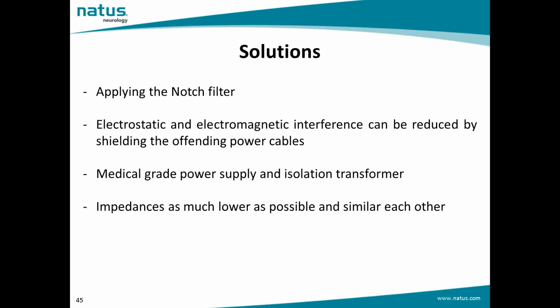A good installation and proper setup of the system assures, in addition to the safety of the patient, a good rejection of electrical interferences by powering all the system's parts using a medical grade power supply for the amplifier, and an isolation transformer for the acquisition PC and any other external parts, for instance printer, monitor, if they are placed in the patient care area and quite close to the amplifier.